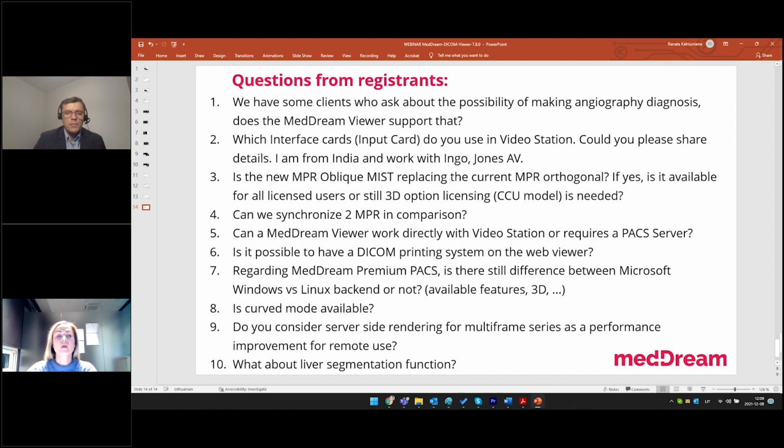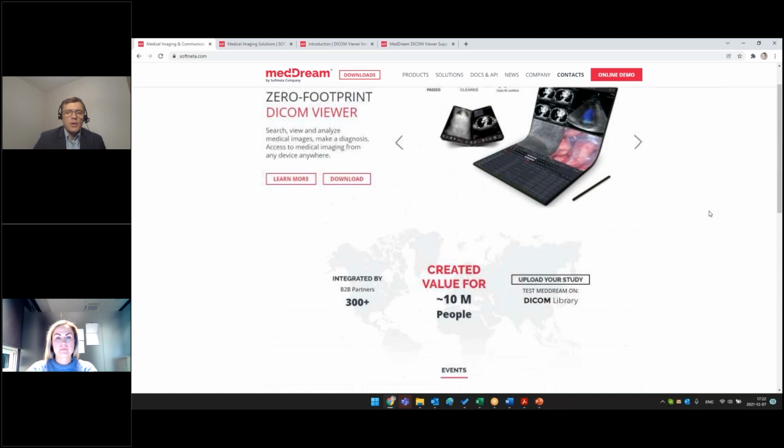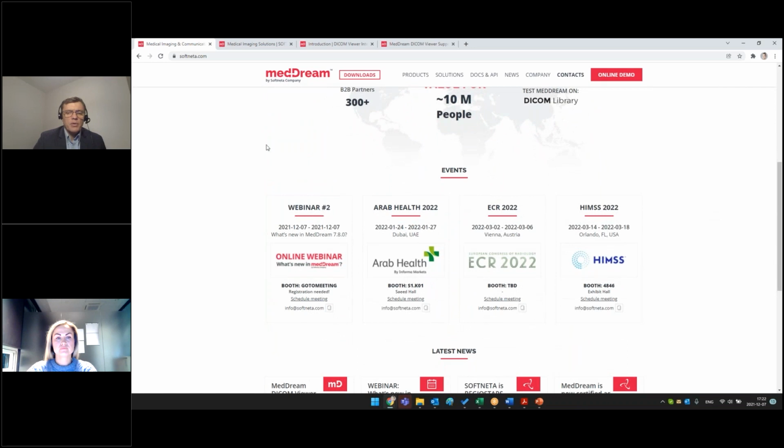Okay, thank you. So I guess for the question, this is it. But we also need to give more information regarding other topics. Yes. So as Renata already explained, we will have quite a big change during the next year regarding the information which we provide to our partners.